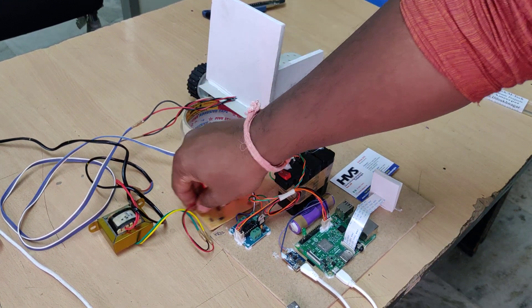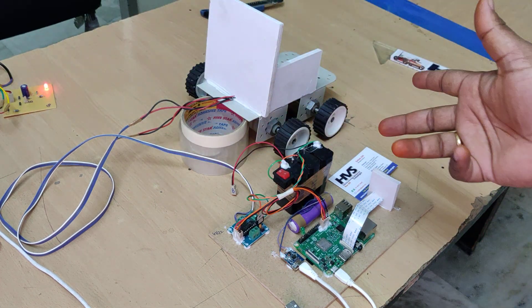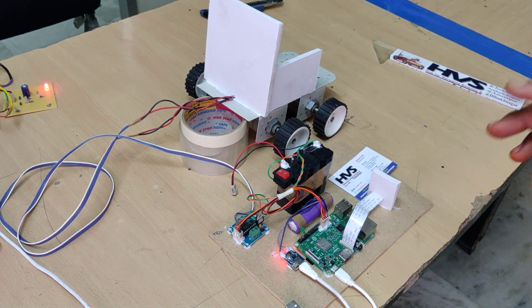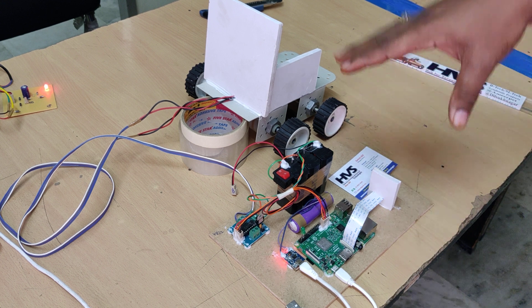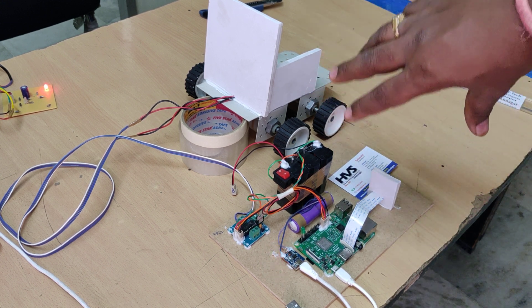We are controlling the wheelchair in three directions: forward, left, and right. If you want to go backward, continuously turn right or continuously turn left until you achieve the backward direction.